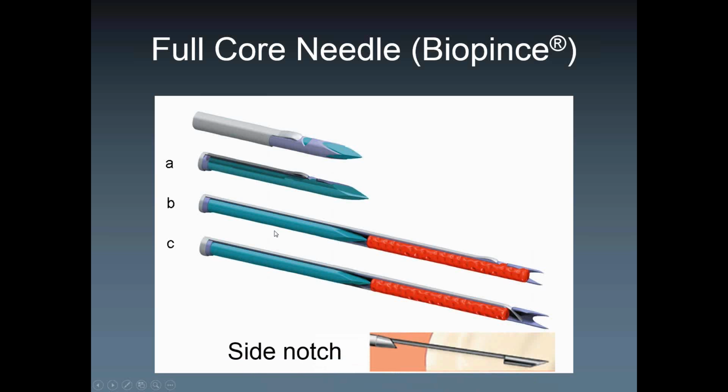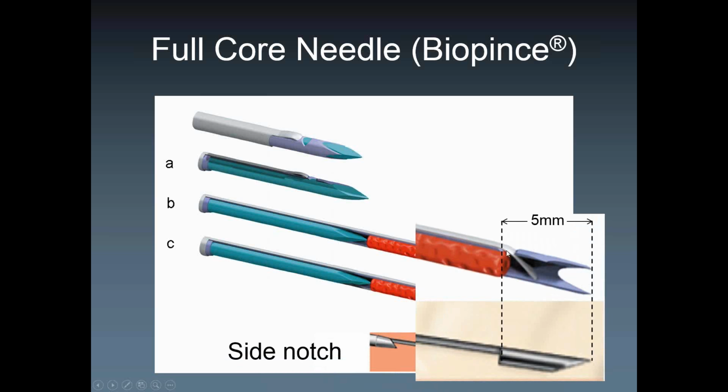All right. What they both have in common, if you compare them side by side, is that the distal 5 millimeters have no tissue. That's important to keep in mind. So with small targets, let's say you have a 1 centimeter target sitting on top of an artery or vein, which you don't want to fire through, you end up having 50% dead space at the end of the biopsy tip, right? And only the other 5 millimeters are going to be core tissue of the target.